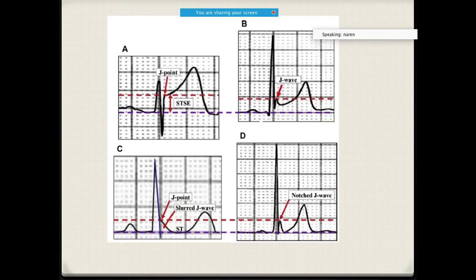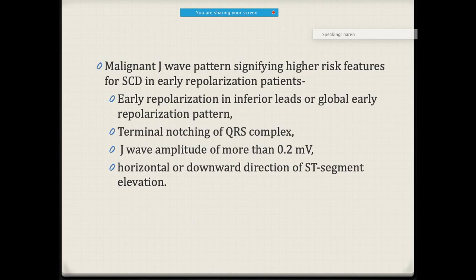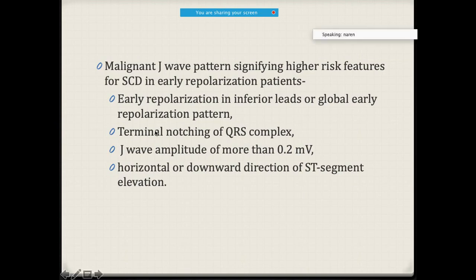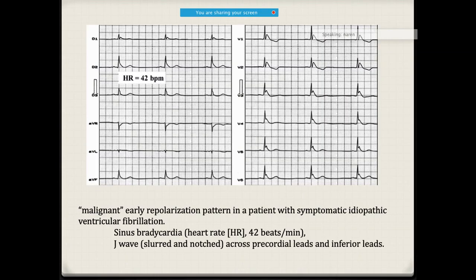So this is how it looks: this is the J-point, and this is how you call it as ST elevation or ST segment elevation. This is the J-wave — a small deflection coming almost after the QRS wave. This is the J-point, and the slurred J-wave. The malignant J-wave pattern has higher risk features for sudden cardiac death in early repolarization patients — early repolarization in the inferior leads or global early pattern — and the J-wave amplitude may be almost more than 0.2 millivolt, and terminal notching may be present.